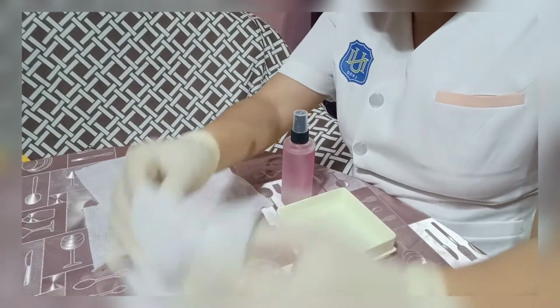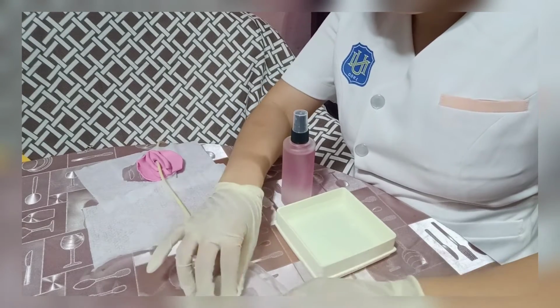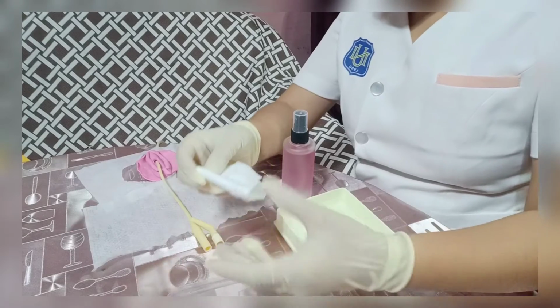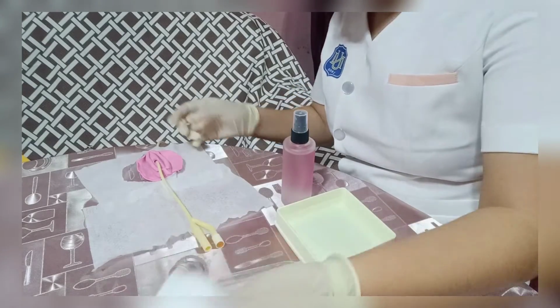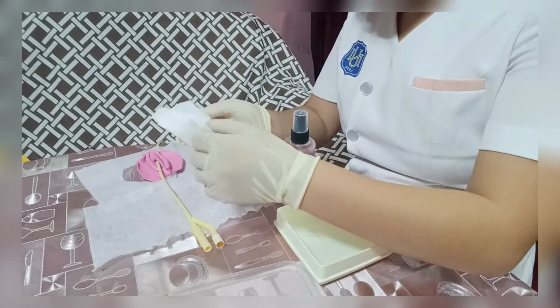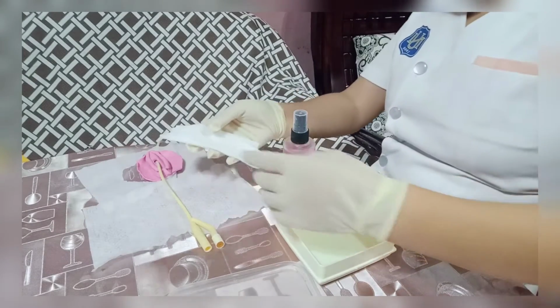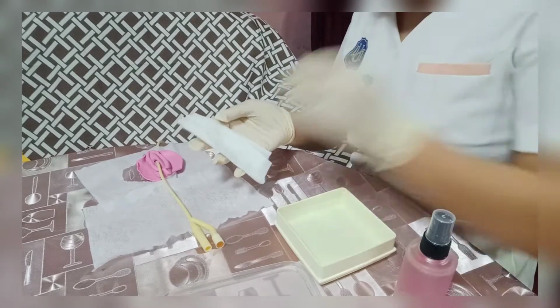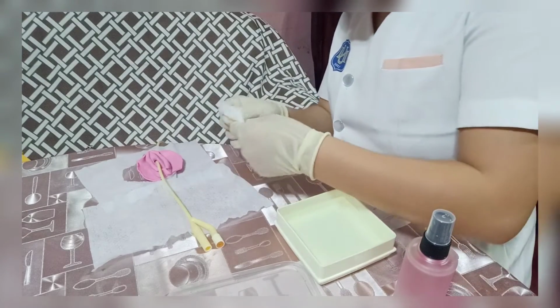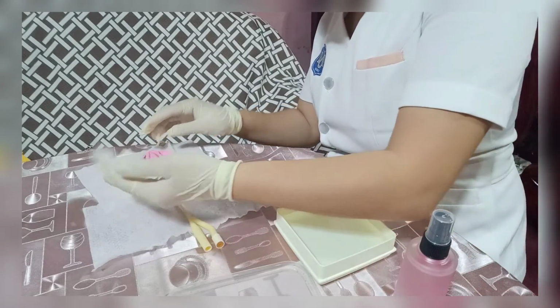Then begin cleaning the catheter 4 inches away from the meatus.